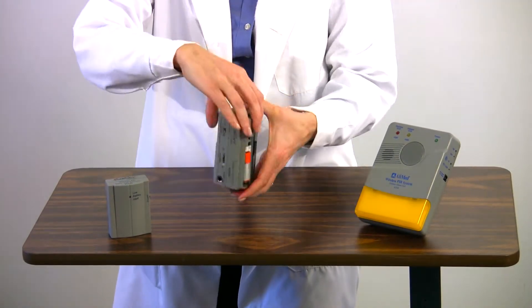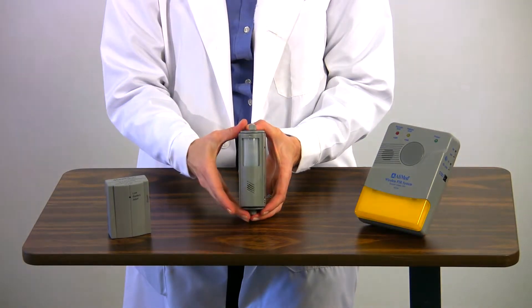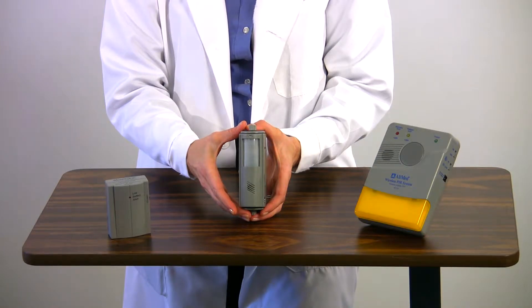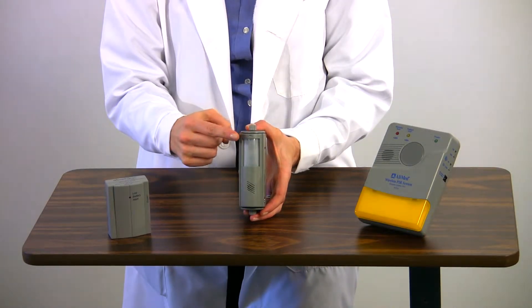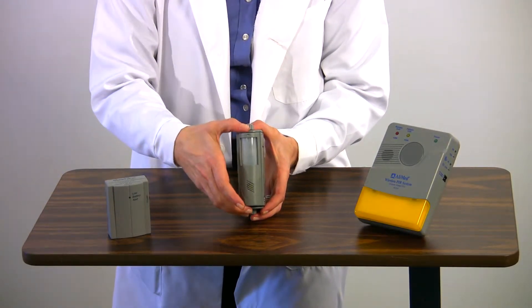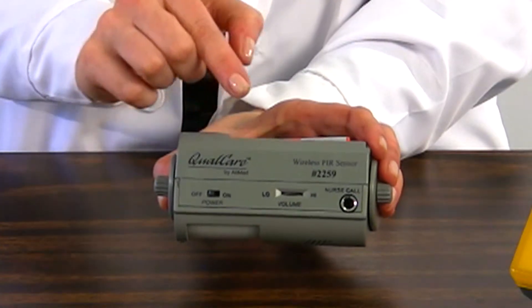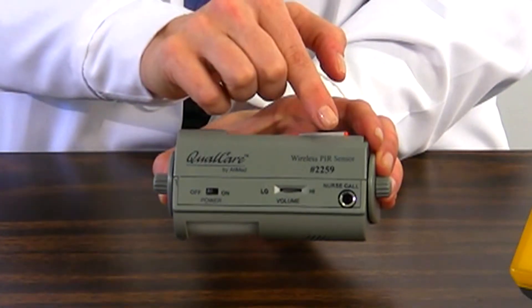On the front of the alarm is the sensing area — this is the part of the alarm that emits the invisible infrared sensing field. Be sure this is the side facing out when the alarm is in use. On either side is the low battery alert light and the speaker where the local alarm sound is emitted. On one side of the unit are the alarm settings, which include the on-off switch, the high-low volume slider, and the nurse call jack. On the reverse side is the reset button.